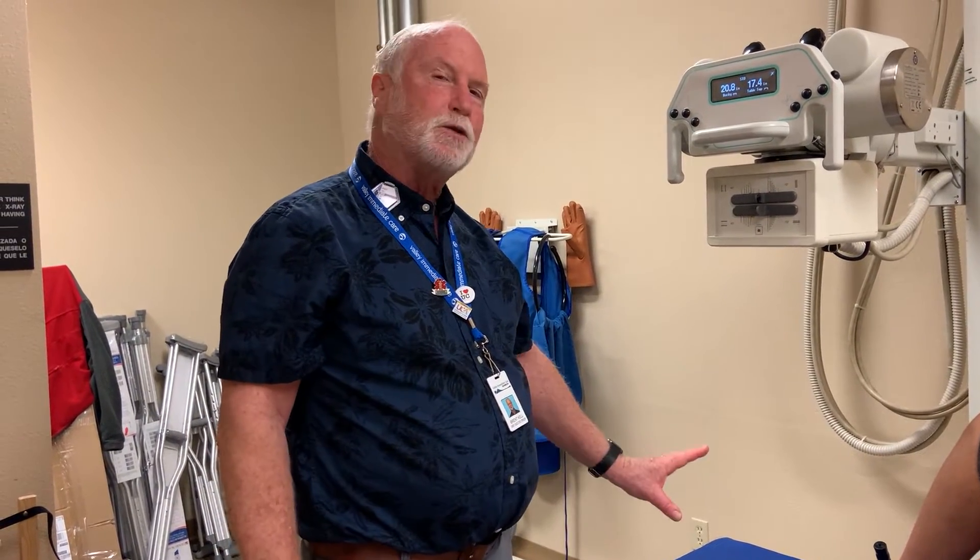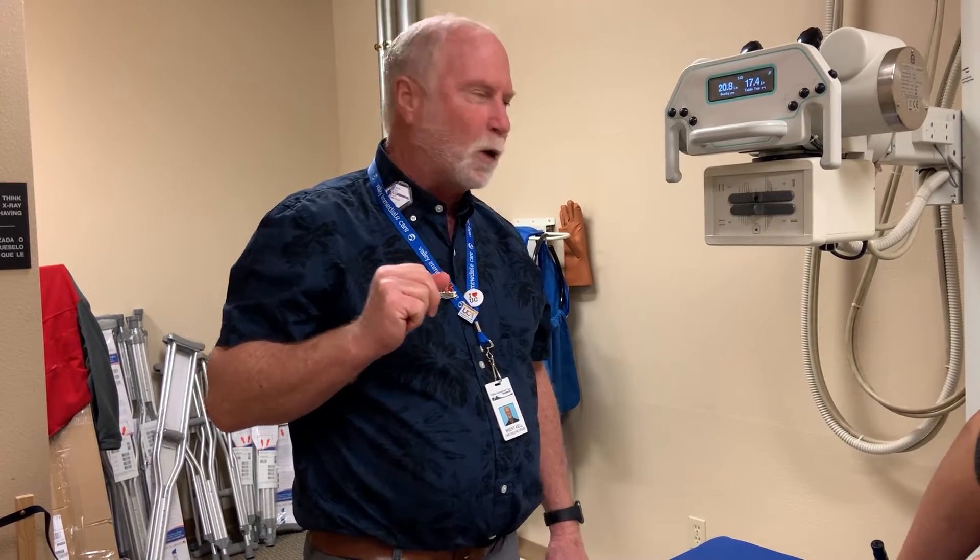We're going to demonstrate toe x-rays. Toe x-rays seem pretty simple, but they can be the most difficult to get, especially when it comes to a lateral position. Most people can stick out their index finger or their middle finger, but not too many people can stick out their middle toe. So we're going to need a little help with this, and maybe use a little bit of tape as well.